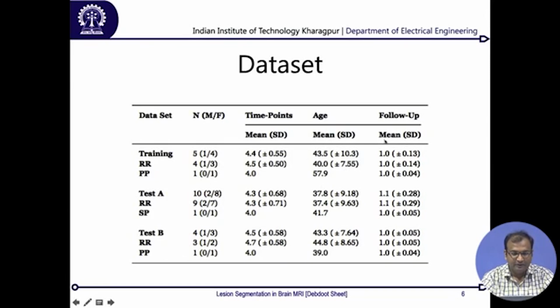Along with that, we also have a duration of the follow up. So once you had the first appearance of the patient, you take after a few months a group of snapshots, and then you see that this kind of lesion keeps on recurring. That's a significant proof that there is multiple sclerosis. Then you wait for a significant period of time, maybe another 4 months, 6 months or something, and then you take another scan.